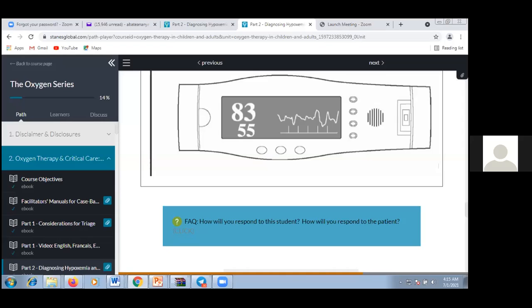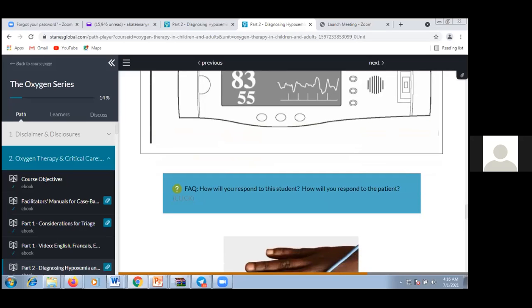So whenever the patient's capillary pulsation is weak or poor, you see on the pulse oximetry the signal strength is very bad or poor or absent. And if there is a waveform, the waveform will not be nicely tall. So in that case, you have to say, this reading is not accurate. And not only that, you have to check the hemodynamic status: is the patient hypovolemic, how is the cardiac output, and things like that.